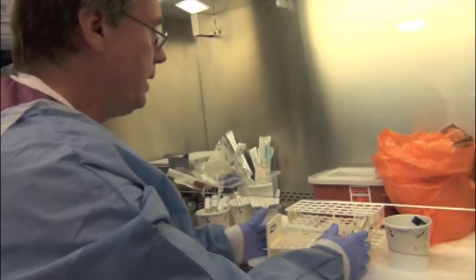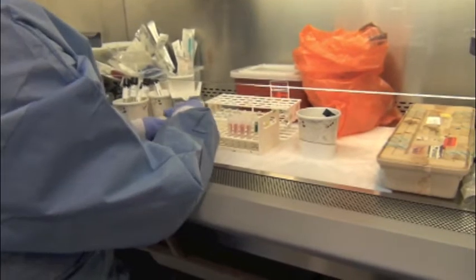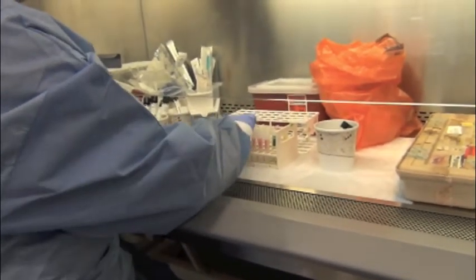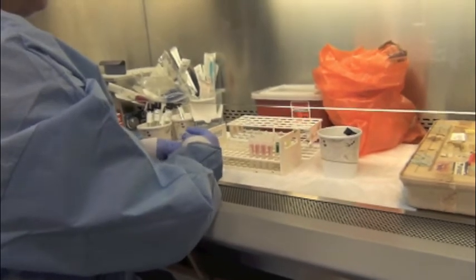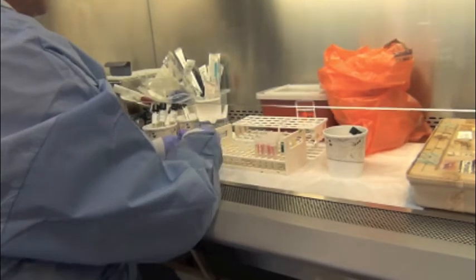So what I'm going to do right now is just add some reagents that I have to add, and then we'll go ahead and add the patient specimen to these lysis tubes.